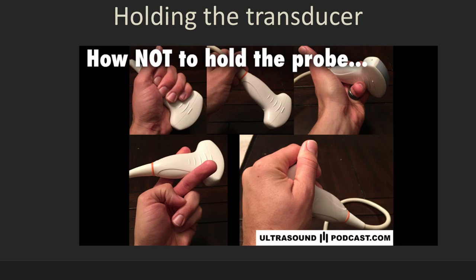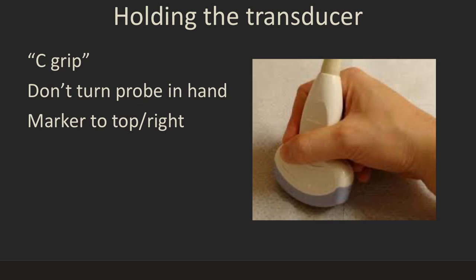First of all, you need to hold the transducer in the appropriate way. Shown here are all ways that you should not hold the transducer. Here is the correct way to hold the transducer — we call this a C-grip, so the transducer is firmly held within the C of the thumb and the first finger. You want to turn your hand and wrist, not turn the probe within it, or you're going to get your orientation upside down.